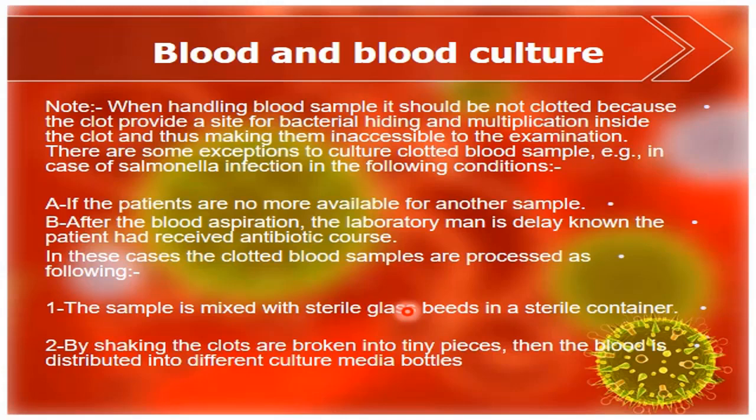Thus it causes disturbances for clotting and releasing of bacteria in the blood. Second, by shaking, the clots are broken into tiny pieces, then the blood is distributed into different culture media bottles.